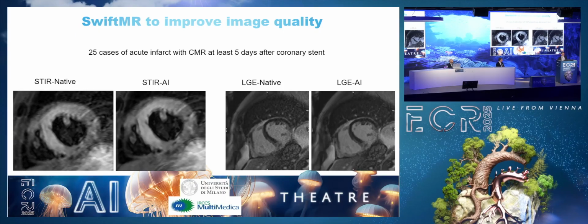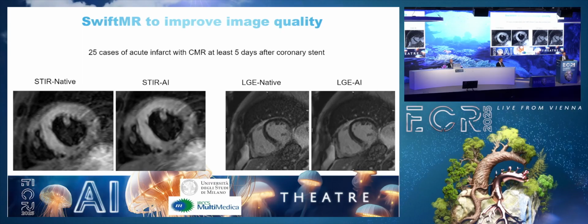So this is a native image. This is an image treated with AI. So of course we have less noise, and this is impressive. And the same in the late gadolinium enhancement, compared to the native and the AI treated sequence.